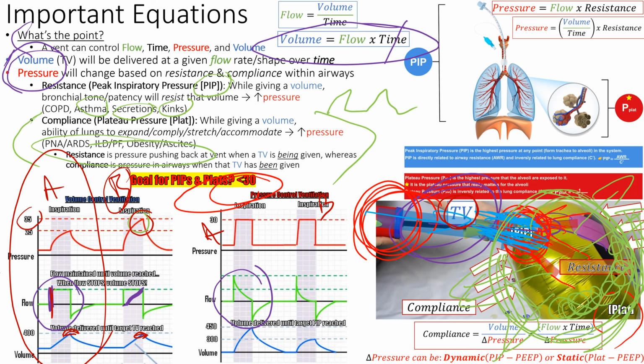On the flip side, we have a patient over here in pressure controlled ventilation, right? So we give a nice big flow, right? But we didn't tell it what volume to give. We told it, I'm gonna make the pressure and keep giving air, keep giving it until you hit 30. How much of that? It could be 1,000. It could be 200. It depends how sick they are. Again, if they have all these effusions, they have ARDS and all these things, you may only get 200. So this patient B is the sick one.